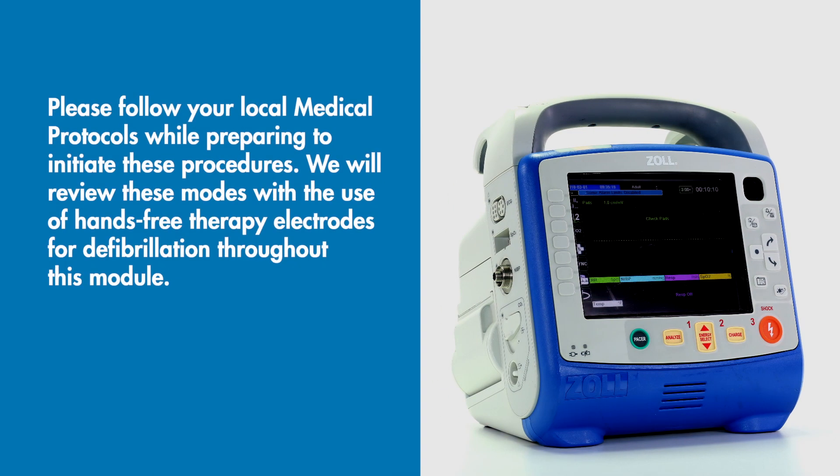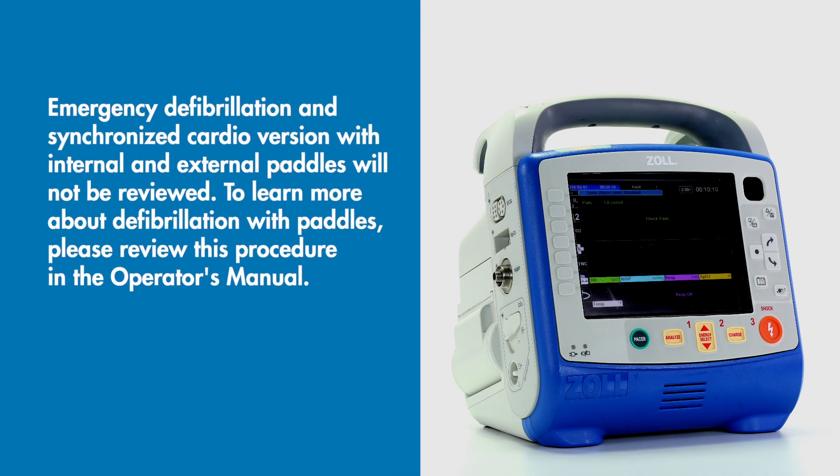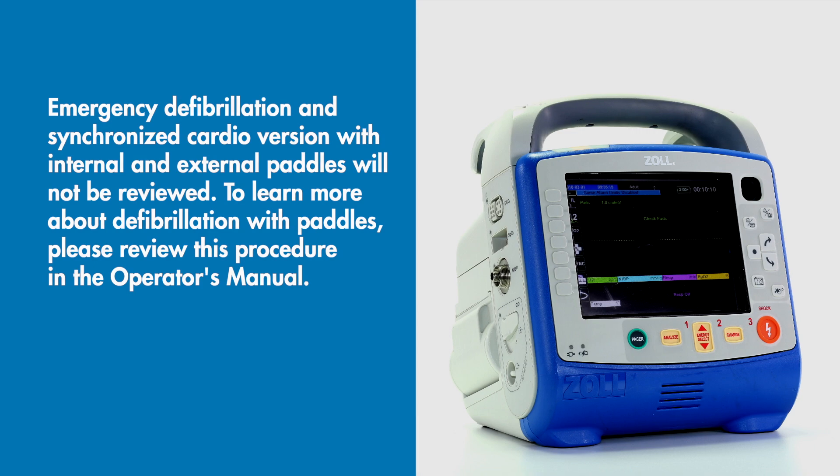Please follow your local medical protocols while preparing to initiate these procedures. We will review these modes with the use of hands-free therapy electrodes for defibrillation throughout this module. Emergency defibrillation and synchronized cardioversion with internal and external paddles will not be reviewed. To learn more about defibrillation with paddles, please review this procedure in the operator's manual.